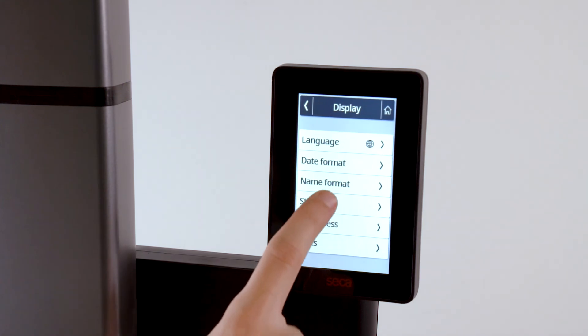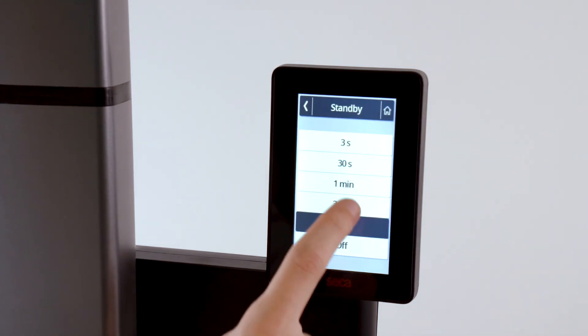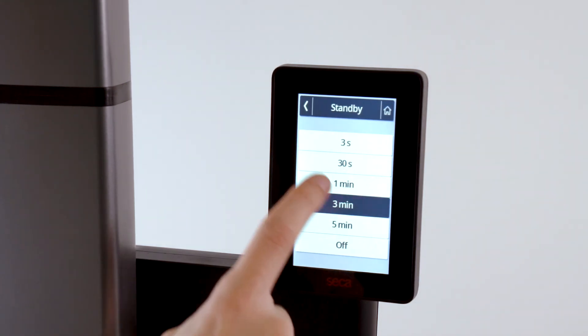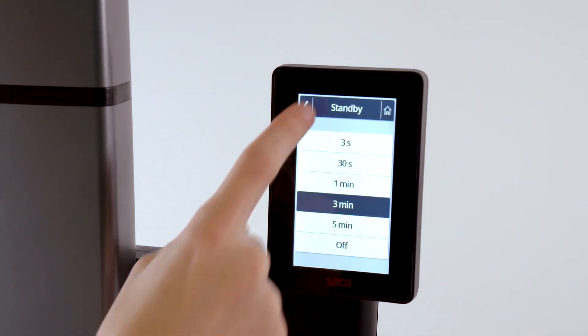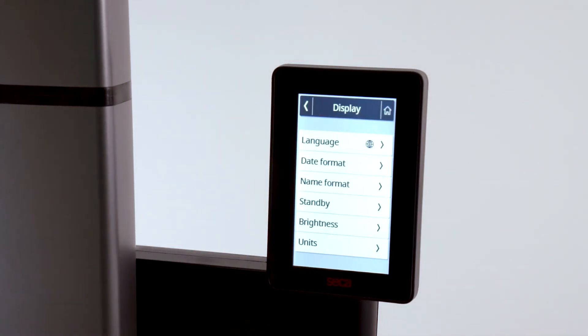Under standby, you determine the time until the standby mode is activated when the device is not in use. We recommend a setting of three minutes.